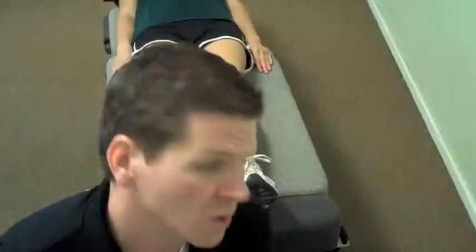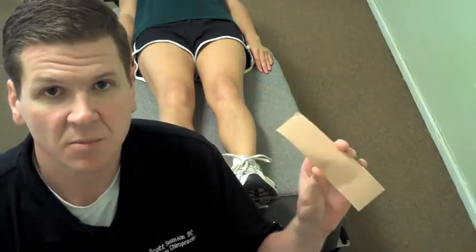Hi, this is Dr. Swanson at Parkside Chiropractic in San Francisco, and the taping we're going to do today is for patellar tendonitis. We're going to use the eye strip technique. You see we've already cut an eye strip to the appropriate length.